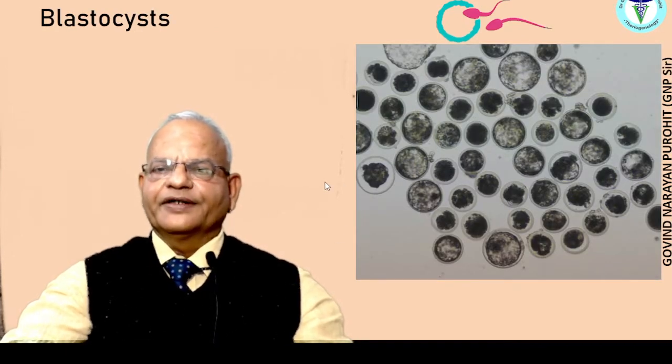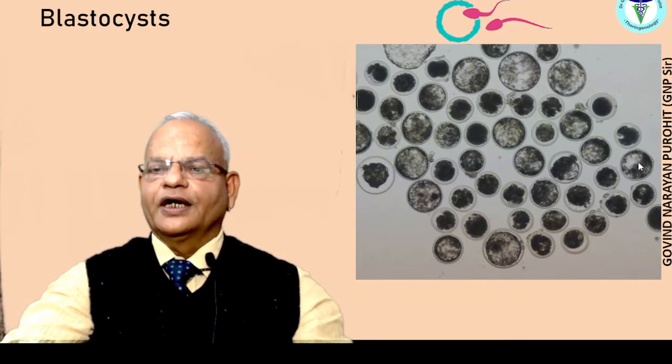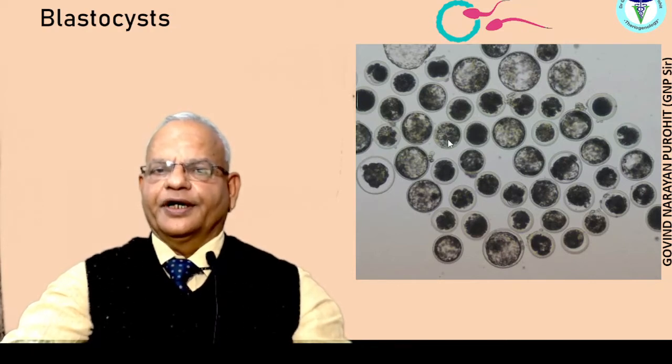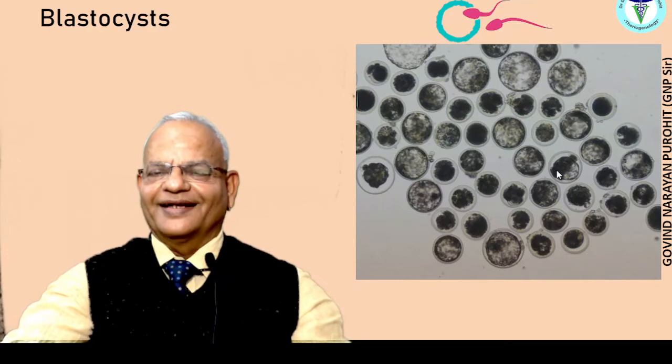The end result should be blastocyst. You can see expanded blastocysts are there. Some of the blastocysts, because a blastocoele appears inside, would be good for transfer. They will be good for use in studies, and you can find a group of embryos that have developed, some of them blastocysts, some of the later stages, or some maybe still hatching. A few might be a hatching blastocyst, as you can see in this one, right? So this is what is desired as the end result in in vitro fertilization.